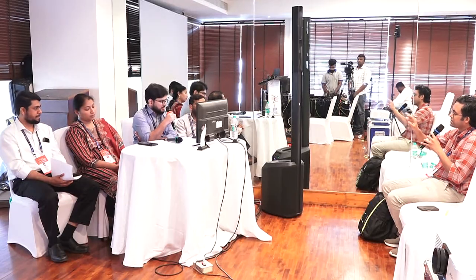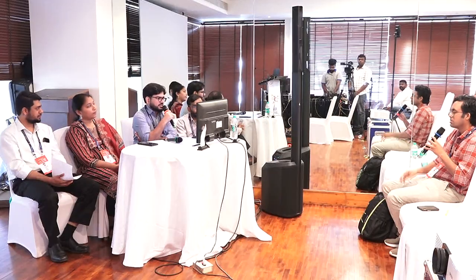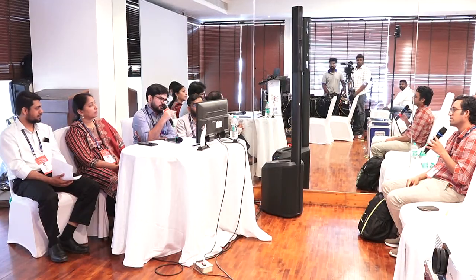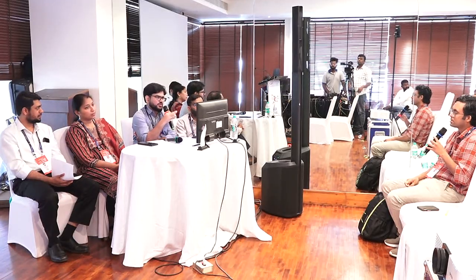You will do a baseline OCT, both RNFL and GCC? Yes, I will do both. And then at 6 weeks, I will see the patient again and repeat the OCT. You will repeat the OCT at 6 weeks? Yes, I will repeat the OCT along with the visual fields as well.